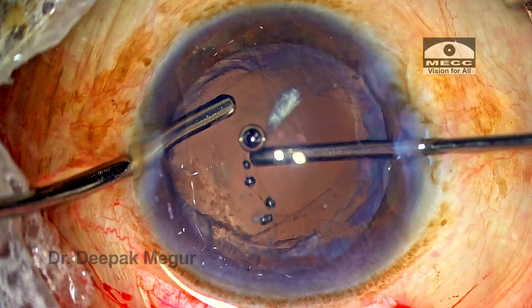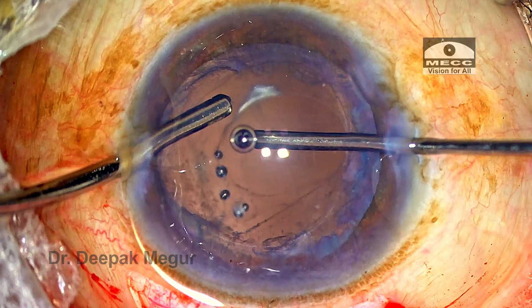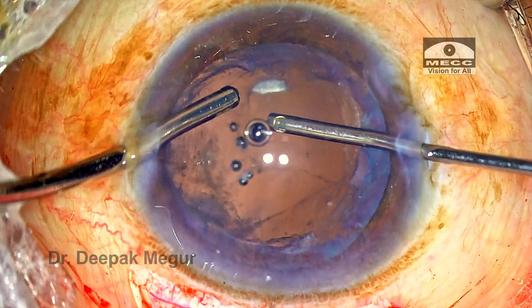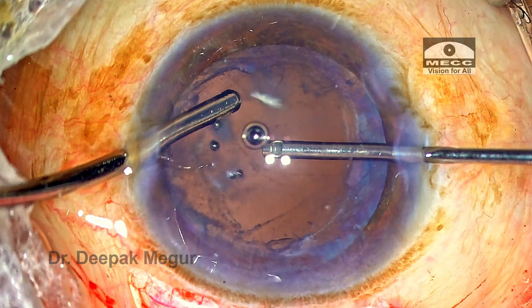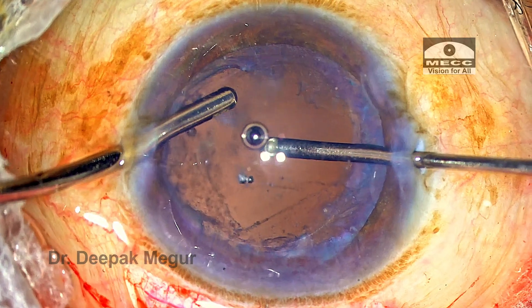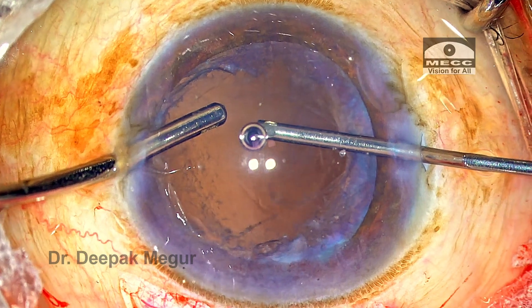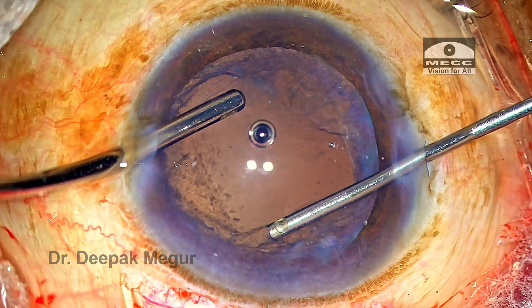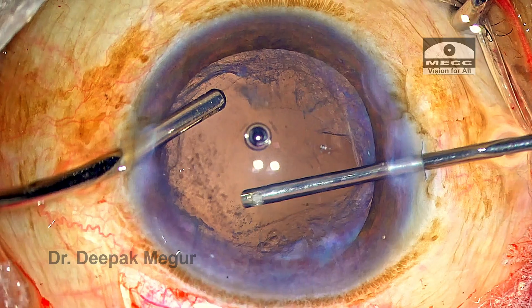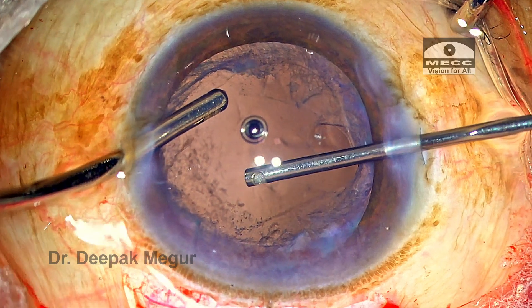She enters the vitreous cutter probe with the bevel initially turned down and begins the cutting procedure. The vitreous is being cut and then aspirated. After some time, the bevel is turned sideways and then anteriorly to cut and remove vitreous from the anterior chamber. One key point to notice: the probe is not being moved around. It is held still at one place while the job is done. Once the vitreous in that area is taken care of, the probe moves to the adjacent area and cutting is begun. We cannot use the cutter as a stirrer — it must be held steady.